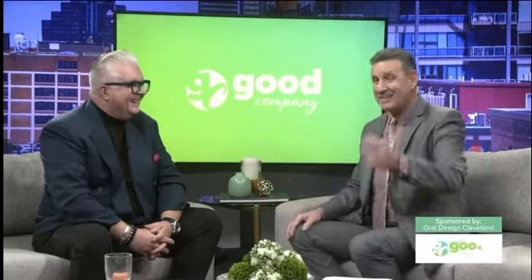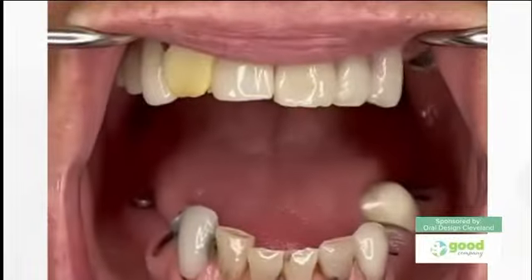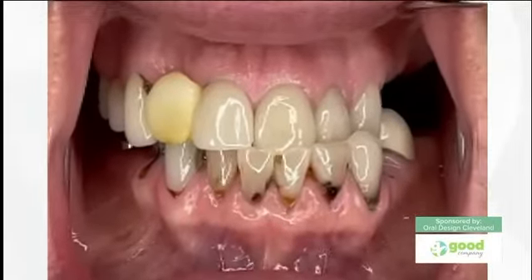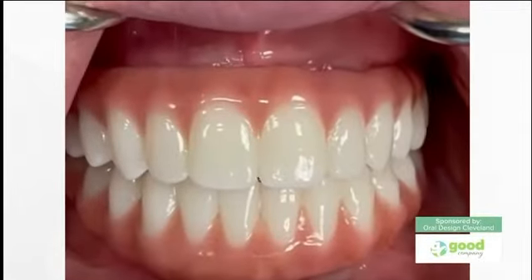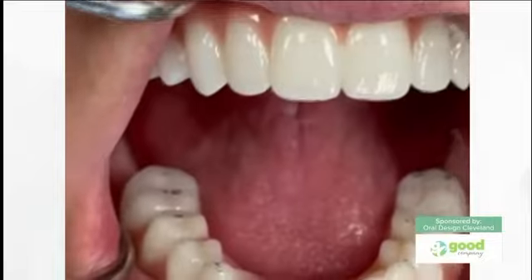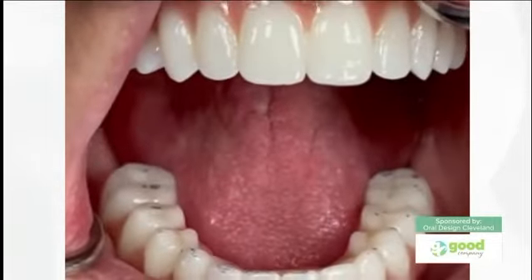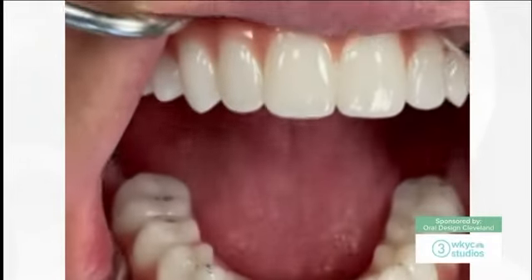How about let's take a look at some of your awesome work. All right. So we're going to see a case here. As you can see, this patient had teeth that were on a downward trend. And so we did an upper and lower case here. And you're going to see in just a moment the result. Look at that. Beautiful zirconia hybrids made by Pincus Adar, Oral Design Atlanta. I'm Oral Design Cleveland. And those are screwed in. She cannot take those in and out. And it just is wonderful.